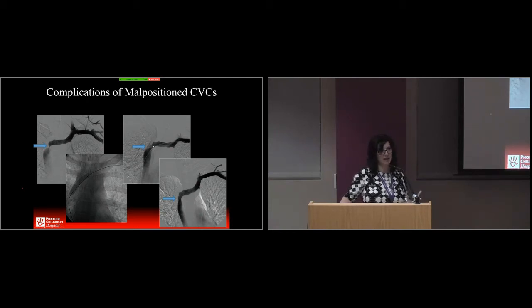When you're doing angioplasty, you're injuring the endothelium. You're injuring the vein wall. So it's not unusual to see contrast extending into the vein wall.